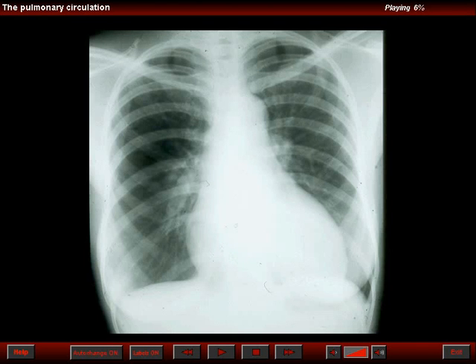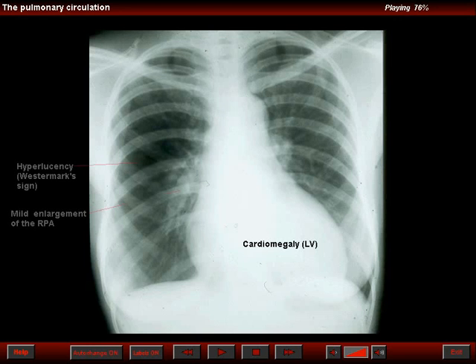This is the frontal chest roentgenogram of a hypertensive patient who suddenly developed tachypnea. Note that the heart is enlarged at the expense of the left ventricle, and observe an area of hyperlucency in the middle third of the right lung with a slight proximal enlargement of the pulmonary artery.